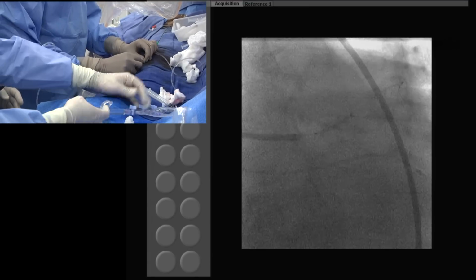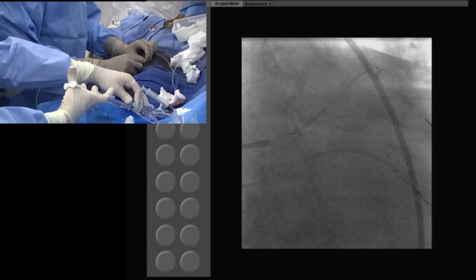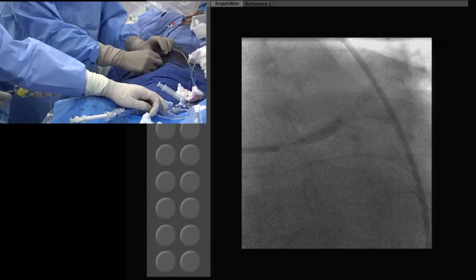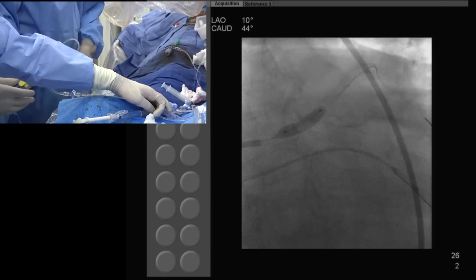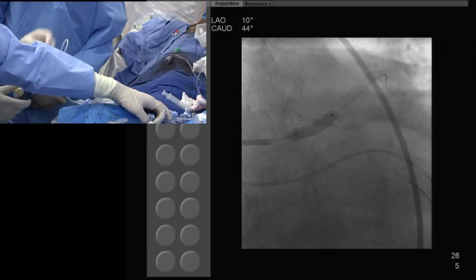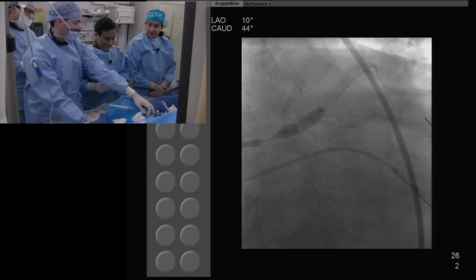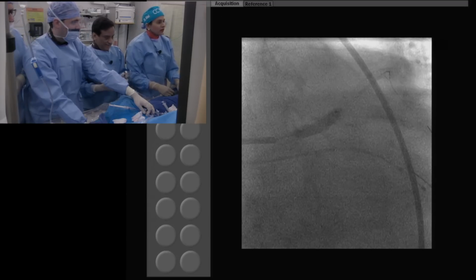Okay, now dye. Yeah, good. Go. Ready? Yes. Okay, this is a 4.0-12 Synergy. Synergy is going to do the magic. Okay, anti-aneurysmal or aneurysmal obliteration stent. Who votes that it will go and who votes that it will not? I can tell you, the aneurysm will become less than 50%. Okay. Less than 50%.